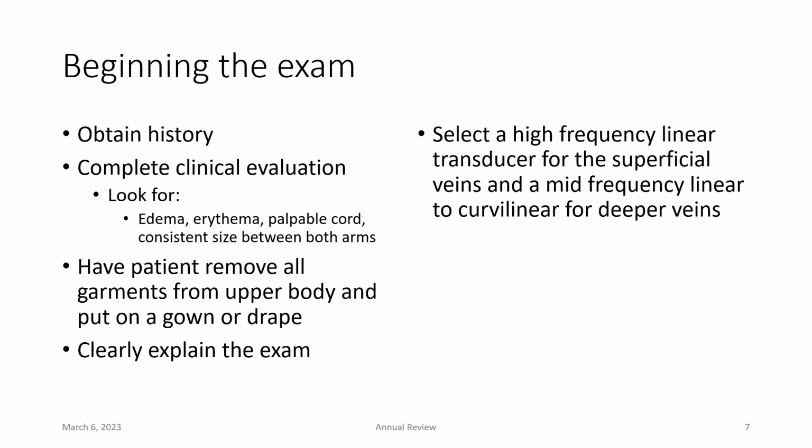Finally, you want to clearly explain the exam. Let your patient know that they're going to be hearing some noises. Let them know that you're going to be compressing, and let them know that their assistance with the exam can make it go much more smooth and quicker for them and be more effective.